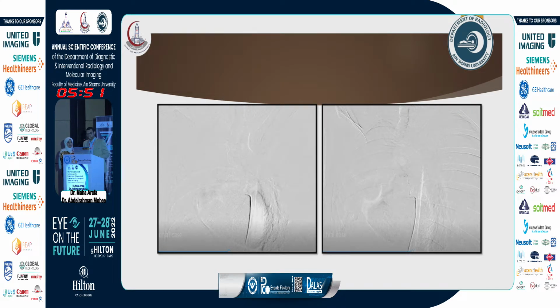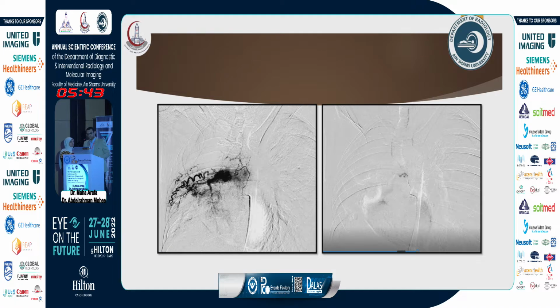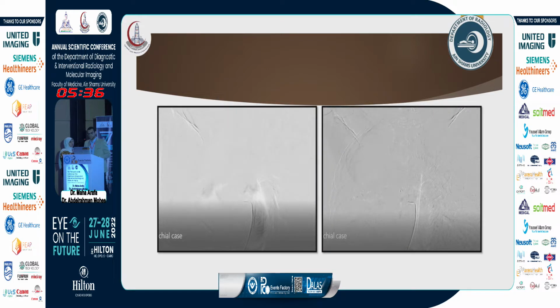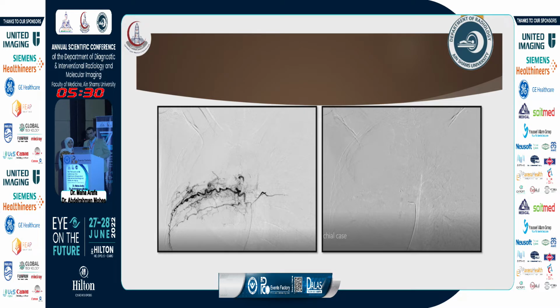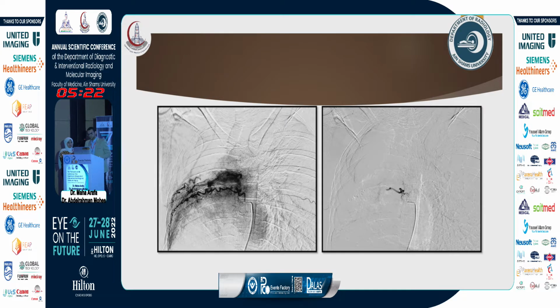This is another artery. Another embolization. So this is the third bronchial artery that was catheterized with another bleeder as well. And this is the embolization.